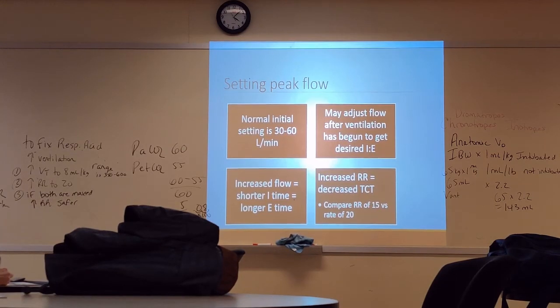Questions so far? This is all stuff we've covered, we're just taking it a little slower, okay? Now, peak flow settings, if you're able to physically set it as a value, some modes have it, some modes don't. Some vents have it, some vents don't. So, when Ms. Polly asks you on your mini clinic, if you have a peak flow, if you cannot find a physical value on the machine, you need to calculate it, okay?